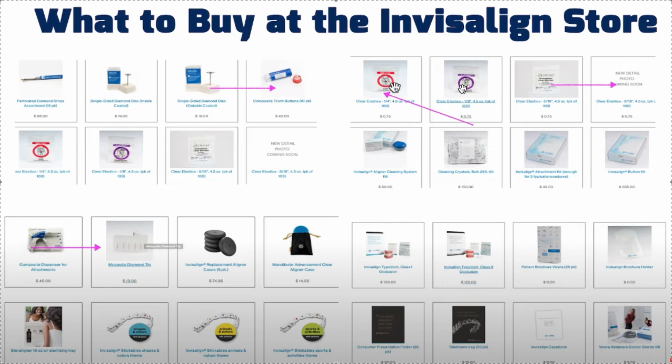One bag lasts about a month, usually. So definitely I would get quarter and 3/16 medium from the store. Get a few if you're going to be doing elastics, and then get heavy ones if you're going to go button to button from eBay. I don't know why they don't carry them here because I use them all the time.